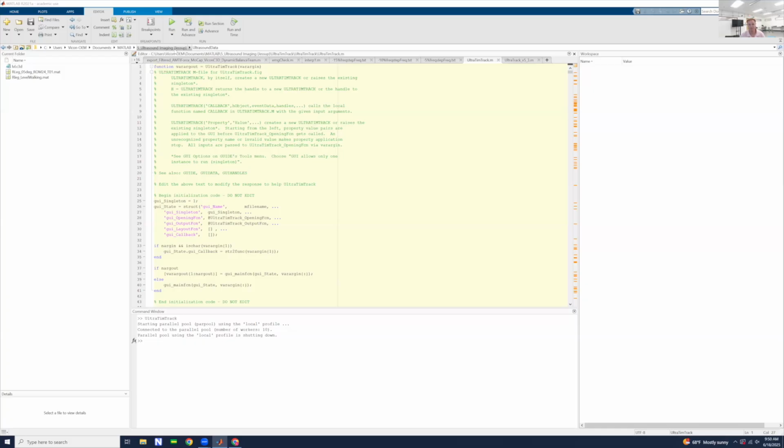I've used that previously for automatically detecting fascicles within my ultrasound image, and then I've taken the coordinates of that fascicle detected in ImageJ and imported that into my ultrasound image as the fascicle. So that's an automated way of doing it as opposed to manually doing it. That add-on, the simple muscle architecture analysis in ImageJ, was created by Neil Cronin, if you're not familiar.